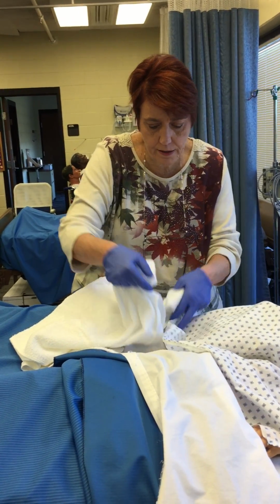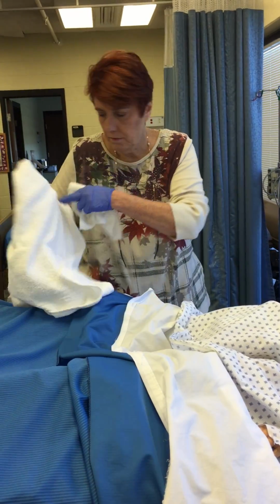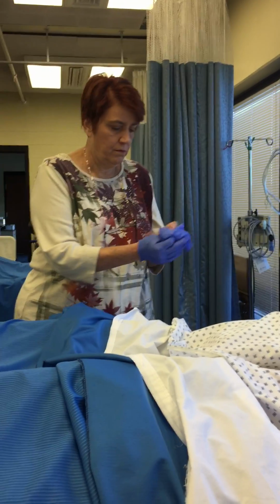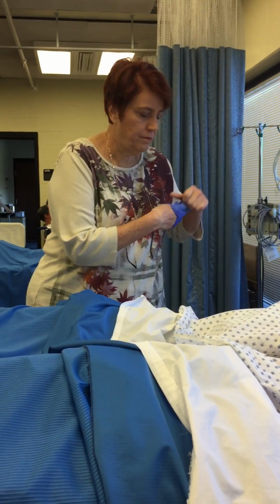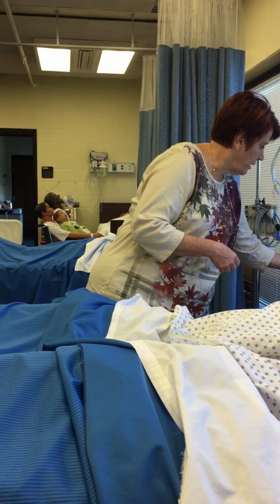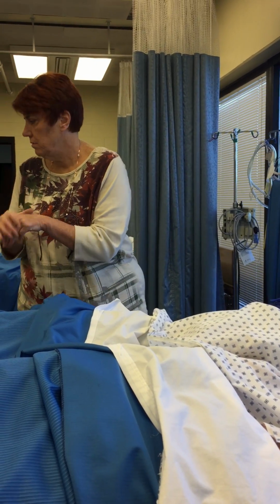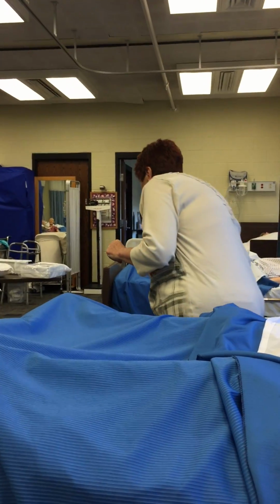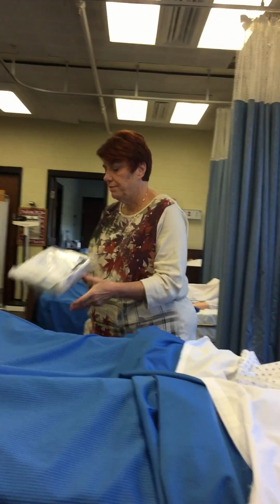You can cover her back up for a minute. And this, of course, goes in the dirty clothes. Wash your hands. Take this catheter kit.